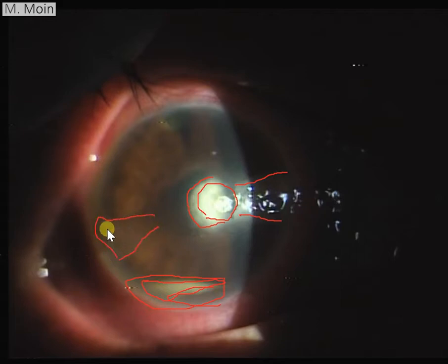And these dots over here. So what is this area? This is actually an area of band keratopathy. So actually this patient had band keratopathy on this side and on the nasal side as well. And there was an area where the epithelium had broken off and this patient developed an area of infective keratitis along with formation of a hypopyon as well.